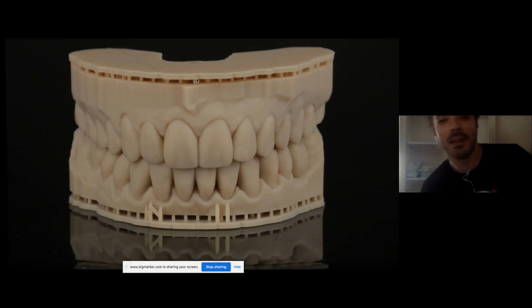Because the thing is like this: when you design, it doesn't matter if it's a crown or a veneer, right? Because you're designing the final, like the future tooth, and you decide if it's a crown or a veneer based on the integrity that you have and on the substrate that you have.